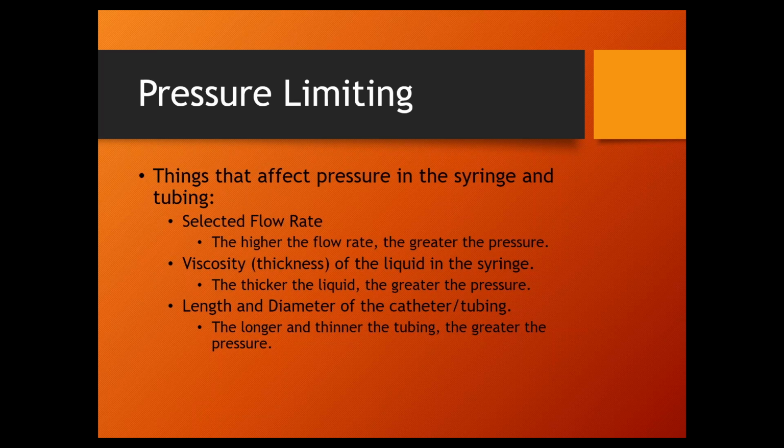If I was in charge, I would tell the industry, you've got to put some color in your contrast fluid, because every year it happens. It's a 1 in 10 million thing, maybe more than that, but every year somebody gets killed by a contrast injector, and it's usually the Stellant. Not because there's anything wrong with the Stellant, it's just by far the most used contrast injector, used over and over, multiple times a day, and there are 2 syringes. One has contrast fluid and the other has saline, which is used for multiple reasons. But contrast fluid is perfectly clear, so when the patient leaves, they pop 2 syringes out, pop 2 syringes in, and fill one. It's been a long day.